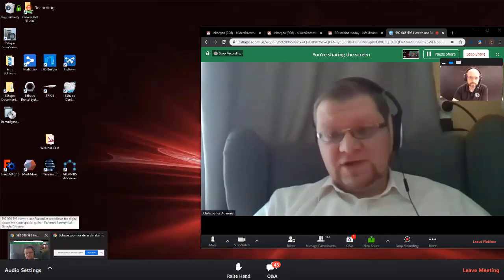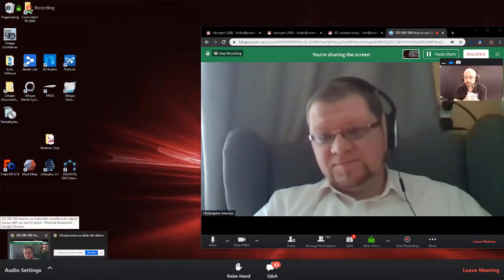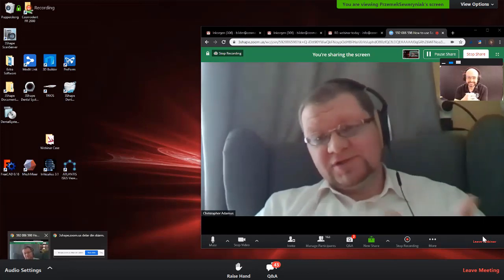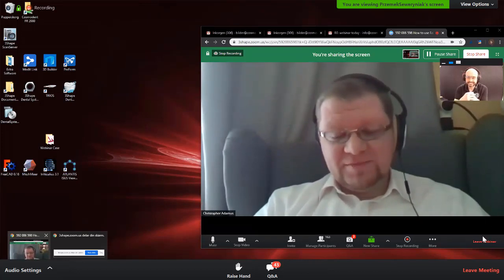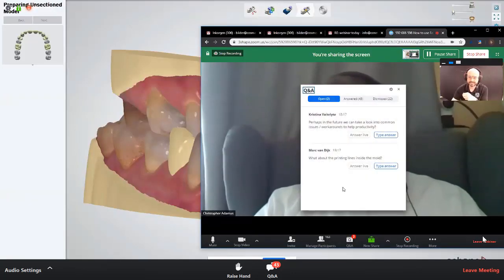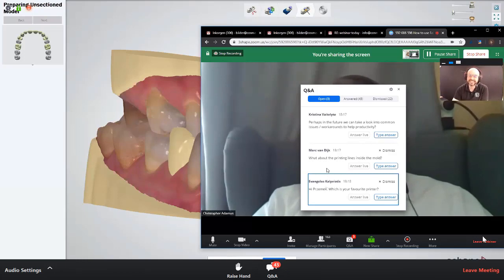So we have a first request for your future webinar. Okay. And that's something that I'm personally having a bit of a problem doing strictly because I am representing 3Shape and we can't sometimes go beyond the specific borders, but people would like to see some workarounds to help the productivity. Okay.